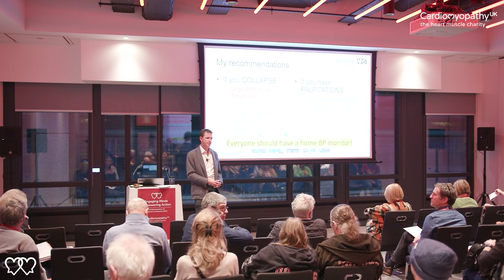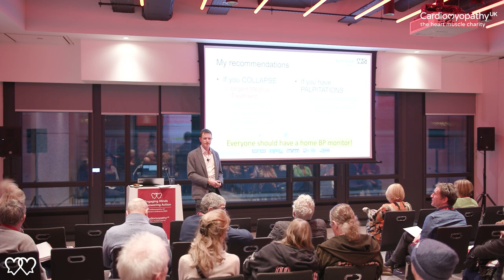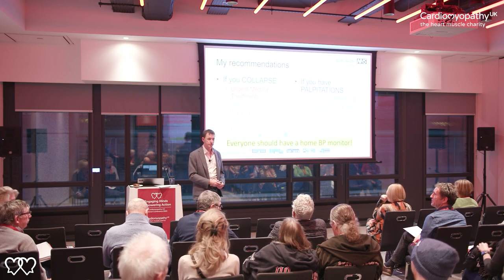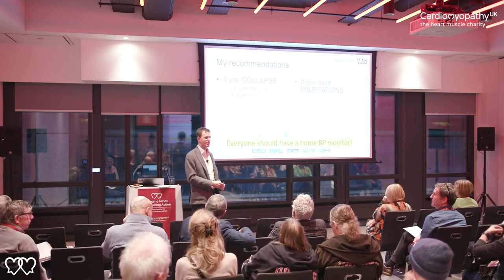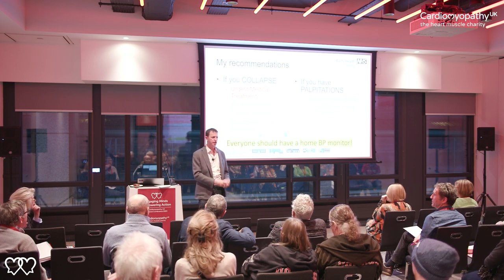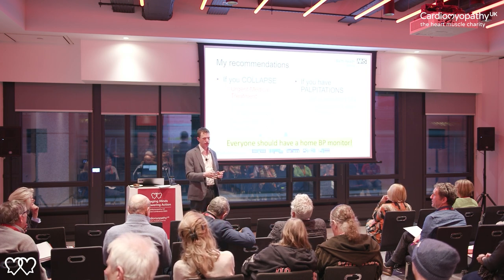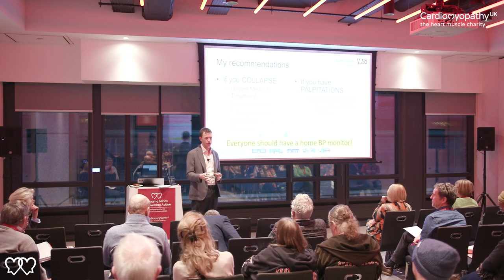There was one that I was really interested in before I just go over to the audience questions, and I think you prepared for it. Can home ECG monitors be used to screen for cardiomyopathy? Okay, great question. I think home ECGs for screening for cardiomyopathy is not proven. I've got to say, I don't think that is a good screening for cardiomyopathy.